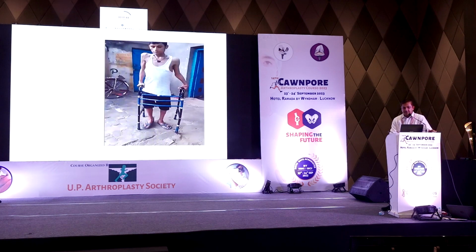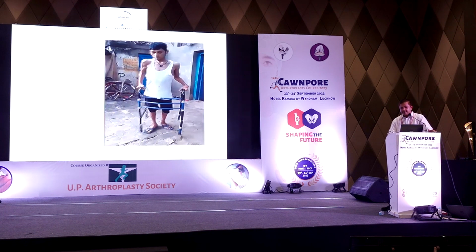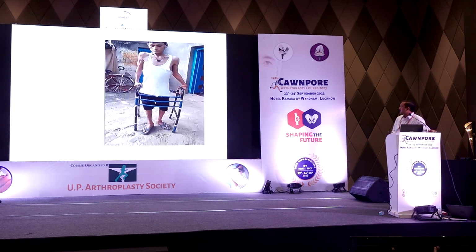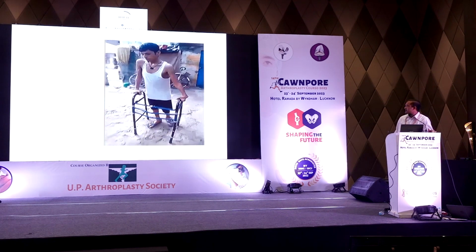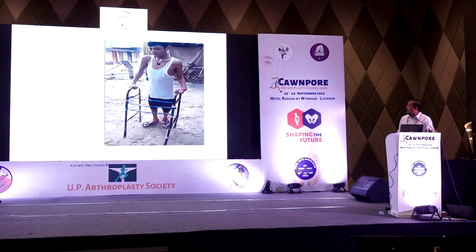I would have been inclined to put two hinges in the knee and done a distal femoral resection, almost a hinge. Both the knees have straightened out.